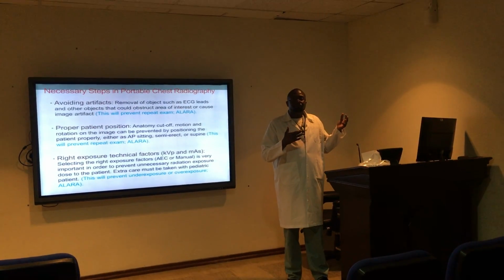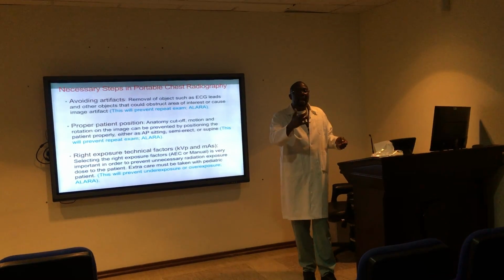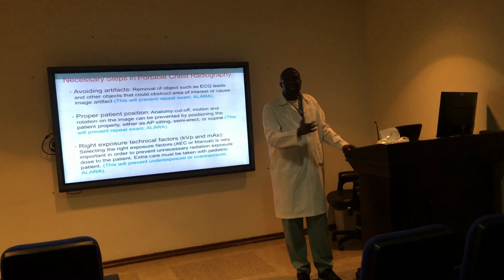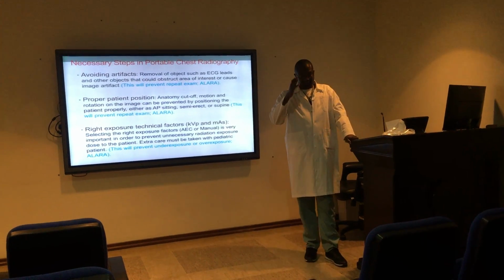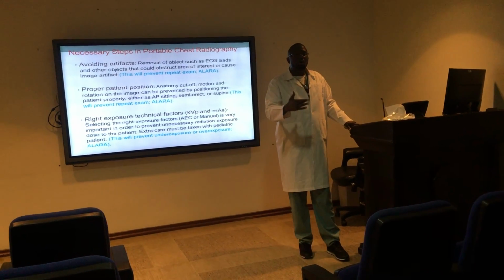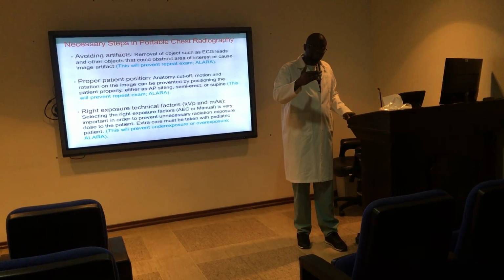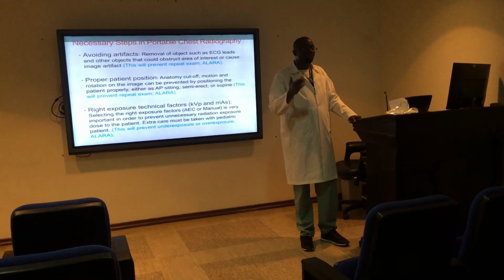will prevent you from producing either an overexposed image or an underexposed image. Either of these could lead to a repeat examination. Again, always have it at the back of your mind. Your goal is to always get a good exam the first time as much as possible.